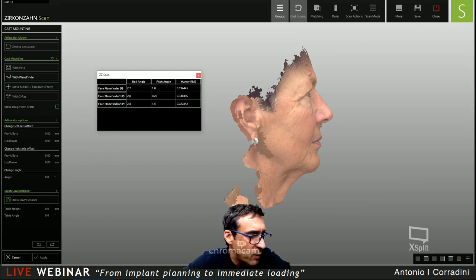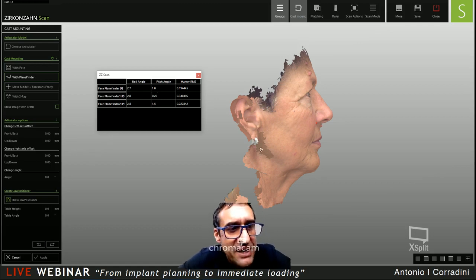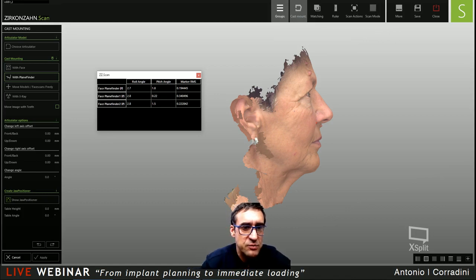And when I scanned the patient with the face hunter, the patient was free, not constricted in one position. I just said, you have to stay in a certain position and I will scan you, nothing else. So it means the system is really accurate and reproducible.